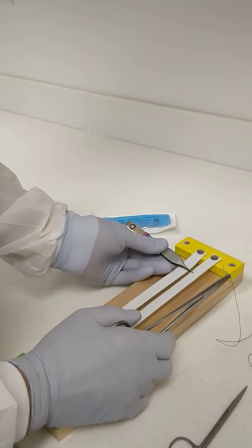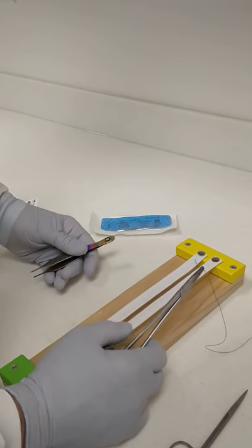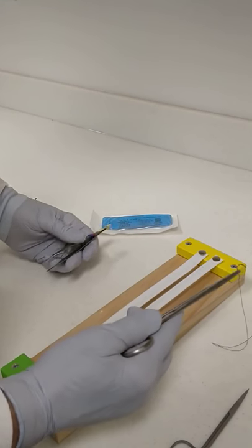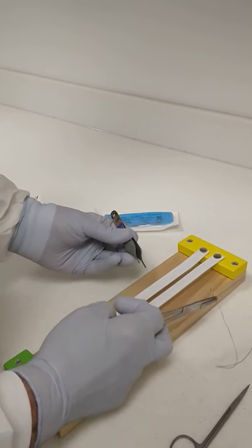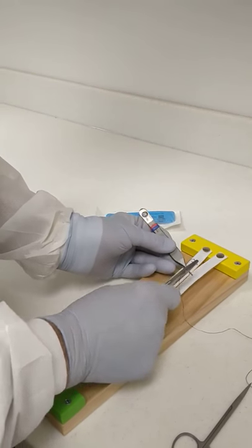As a dentist, you're going to have an opportunity to do several different types of suturing. The most common, of course, is the simple interrupted suture.